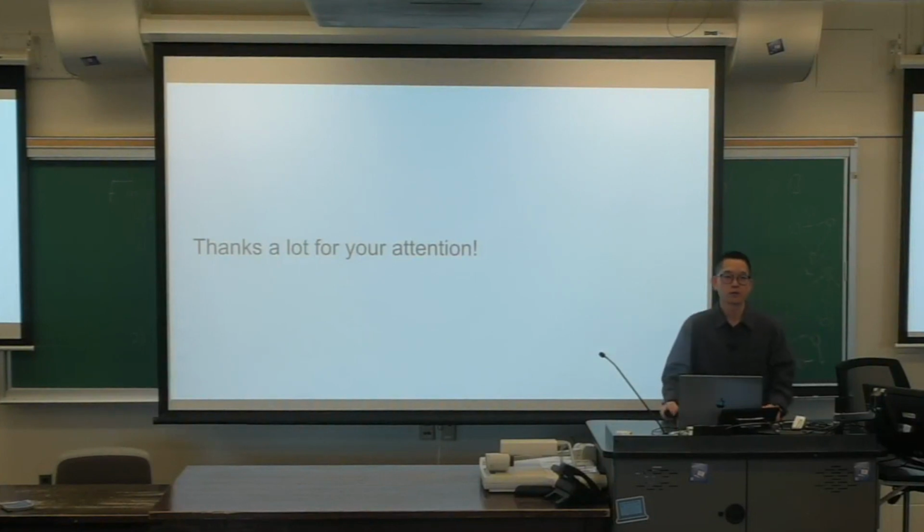How many more features are introduced with the new sensors for the second approach? How many more new features? Yeah. There is the IMU, which gives, I think, 6 values because it's position plus orientation. There's a pressure sensor, which is a single value, and there's motor position, which is also a single value. Before, we had 8 features, 8 channels from the EMG armband. Now we are adding 8 more, so double the number of features.